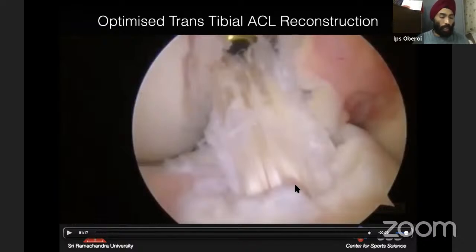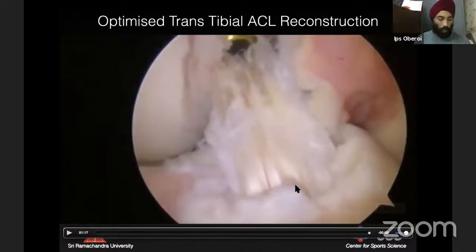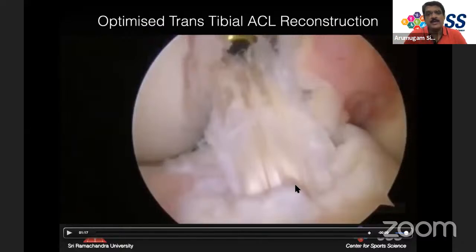If intra-articular fluid leakage occurs during patellar tendon harvest, it is due to not preserving the fat pad. If the fat pad is damaged, close the defect at the end of the procedure. Regarding why trans-tibial is used instead of medial portal femoral drilling for BTB: with medial portal drilling, the patellar bone plug must be less than 20 mm (ideally 18-19 mm) because the graft must flip from below. This compromises the desired 25 mm bone plug length.